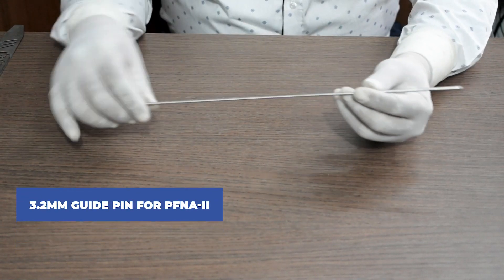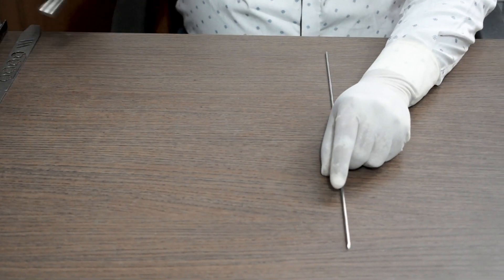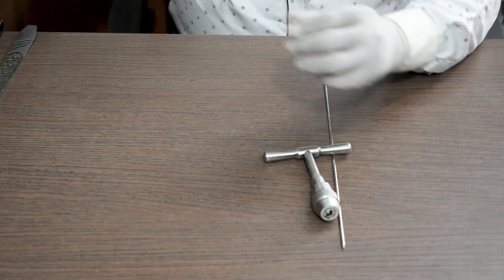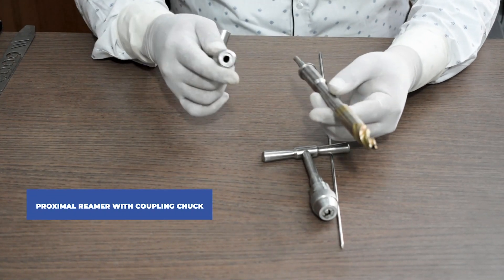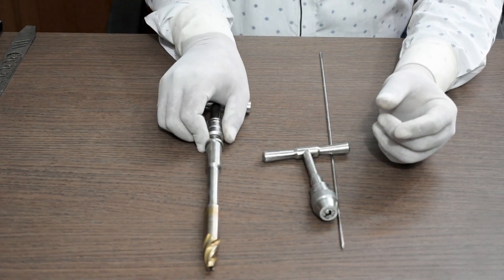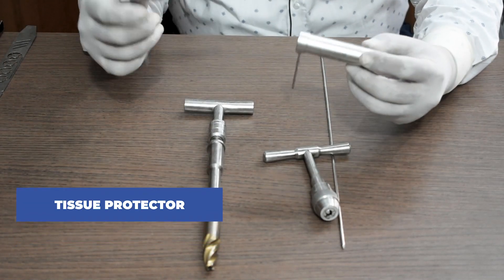This is the 3.2mm guide pin for PFN A2. This is a T-handle chuck with key. This is a proximal reamer with coupling chuck — you can fix the chuck here for a better grip while reaming. This is a tissue protector.